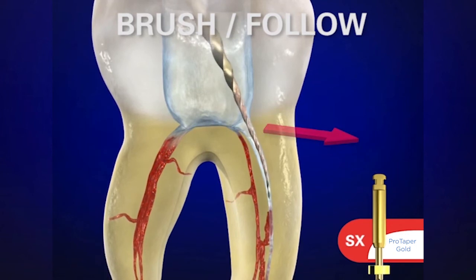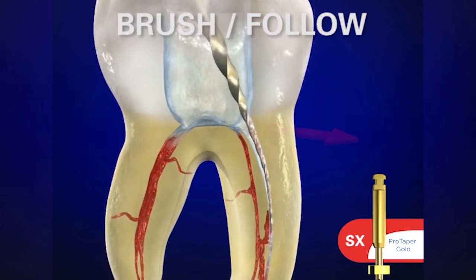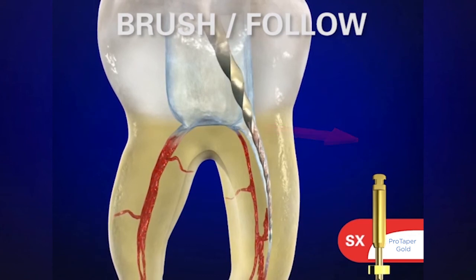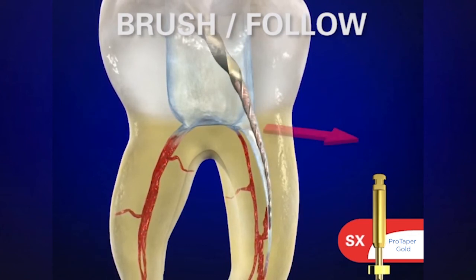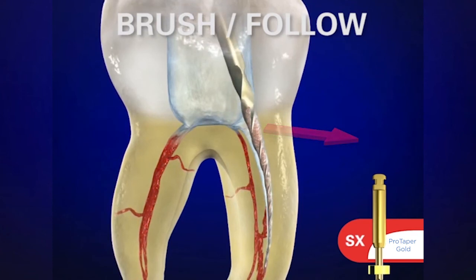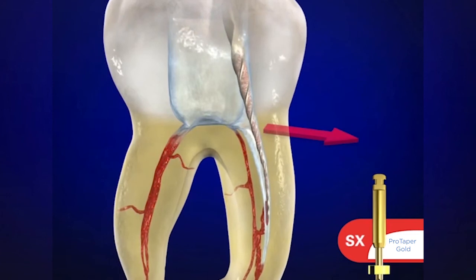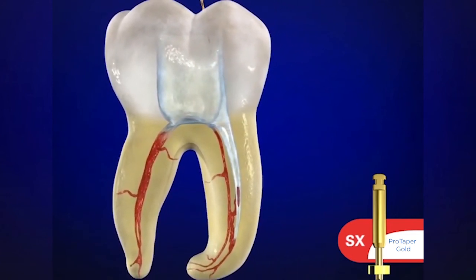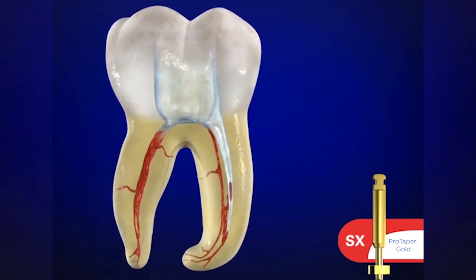We use it in a brushing motion and intentionally brush to the outer wall. The name of the canal you're in is the wall to cut — so in the MB, we're cutting out towards the MB line angle. Notice how the instrument is loading up; you can see where the debris is to know exactly where you're cutting. Very quickly, in just a matter of seconds, we can have a really good shape going in the body of the canal.